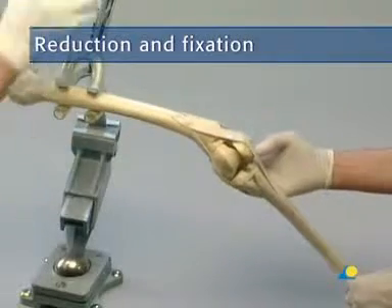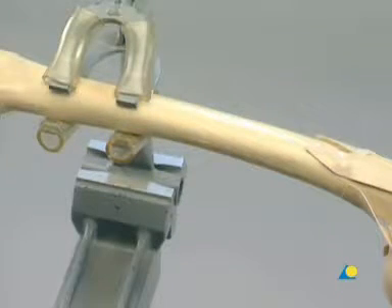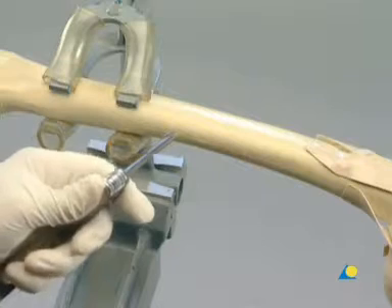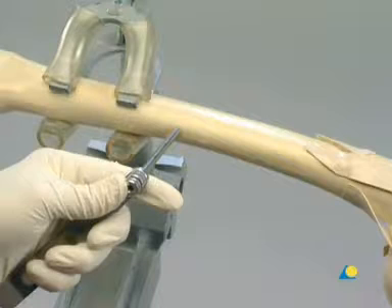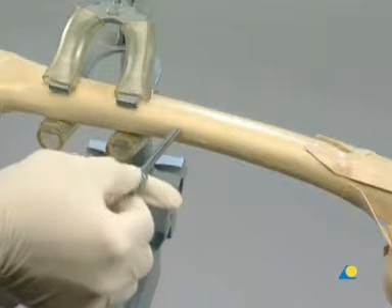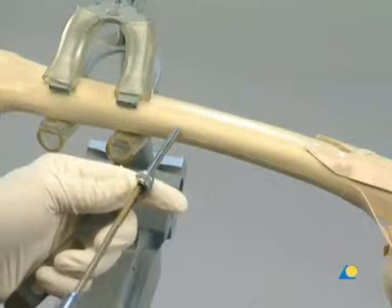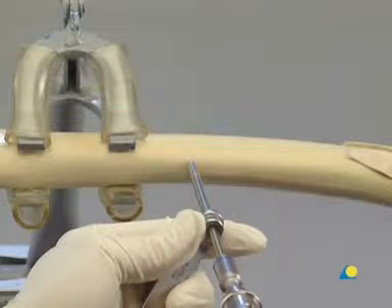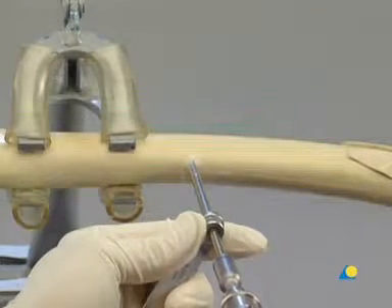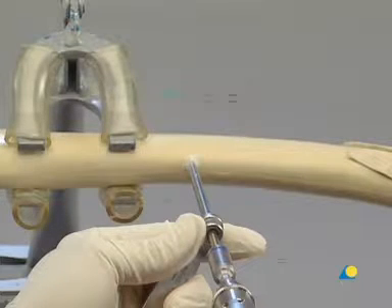The bone model is secured in the clamp as if the patient were in a supine position. The drill sleeve assembly is placed directly onto the bone surface in the mid-portion of the femoral shaft in the direct coronal plane. The trocar is removed and, since self-drilling self-tapping Schanz screws are used, the drill sleeve is also removed. A Schanz screw is inserted into the adapter and the power drive is used to advance this first self-drilling Schanz screw. The drill sleeve is positioned to ensure purchase of the Schanz screw in both the lateral and the medial cortex.